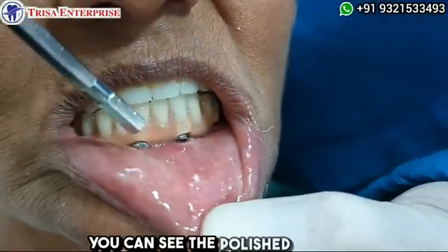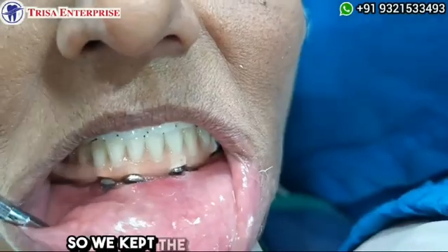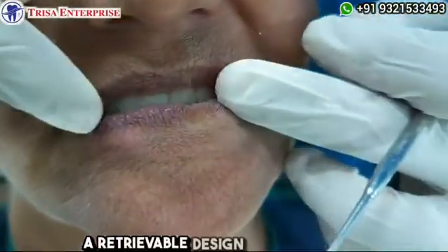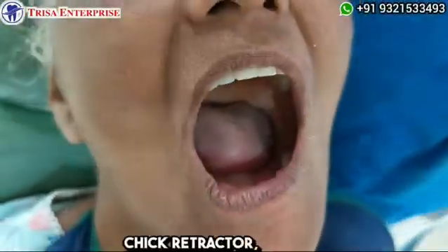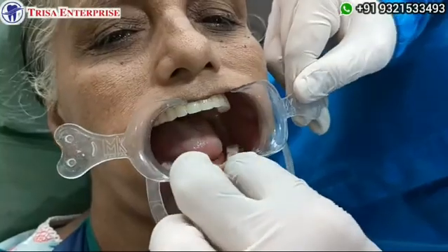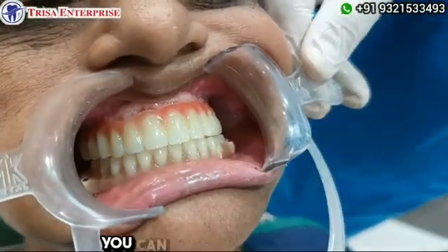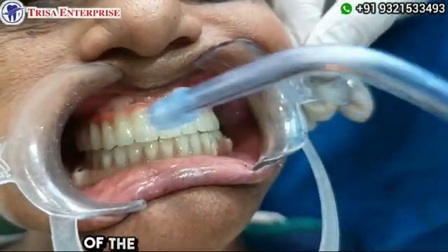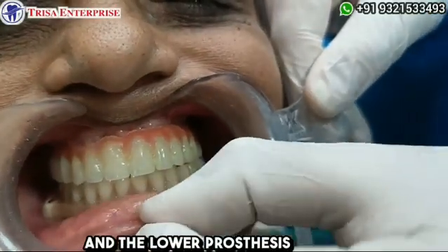You can see the polished collar — there is no attached gingiva at all, so we kept the supragingival margins with the polished collar and a retrievable design in the lower bite. You can see the perfect flush of the prosthesis in the upper jaw and the lower prosthesis as well.